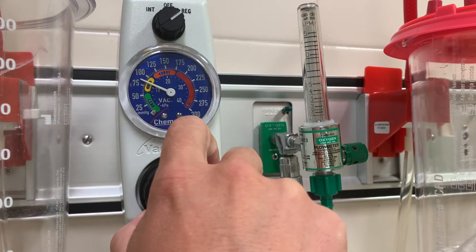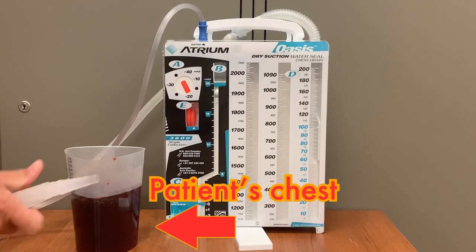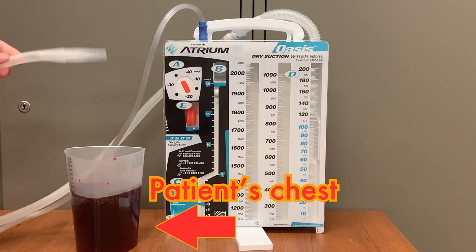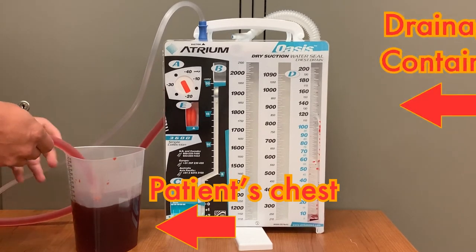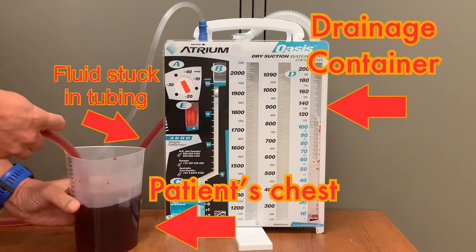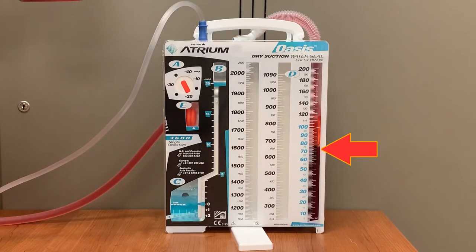With suction turned on and attached to the Oasis, the chest tube should begin to drain. For this demonstration, this container will serve as the patient's pleural space and the red fluid must be removed. When the drainage container is above the level of the patient's chest, the drainage cannot reach the Oasis container. This could be very dangerous for the patient as the fluid that is trying to be drained will be trapped in the patient's chest. When we lift the chest above the level of the drainage container, the fluid easily drains into the Oasis.